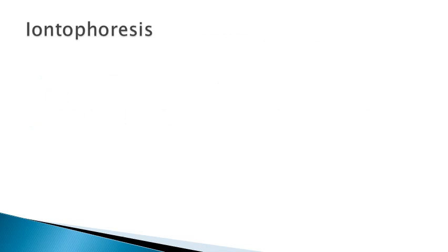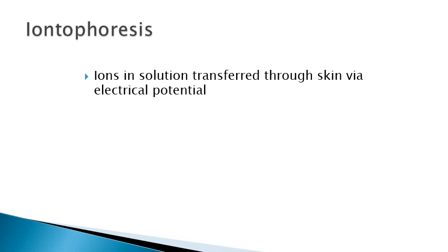So iontophoresis, I talked about this a little bit in class. It's when ions in solution are transferred through the skin via an electrical potential, so what you're essentially looking to do is take a medication and actually drive it through the skin. Unlike phonophoresis, which we said the research is kind of iffy on, though some people still do utilize it, iontophoresis is found to be pretty effective. The depth of penetration is not very deep, so it does tend to work better in more superficial regions.